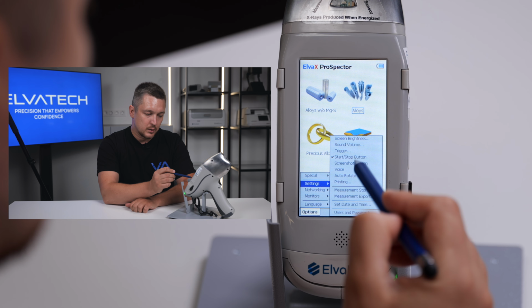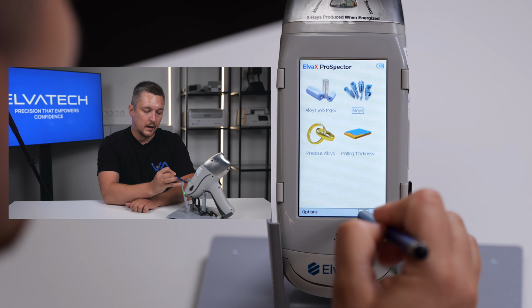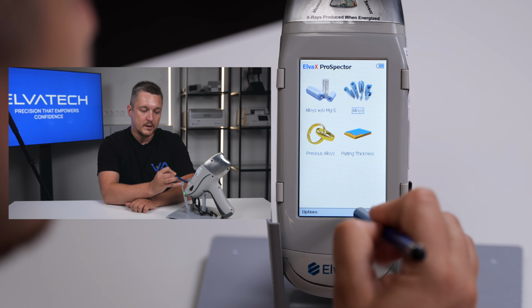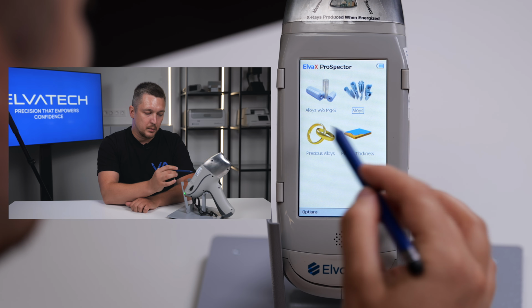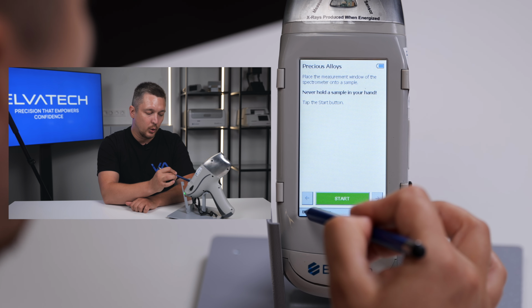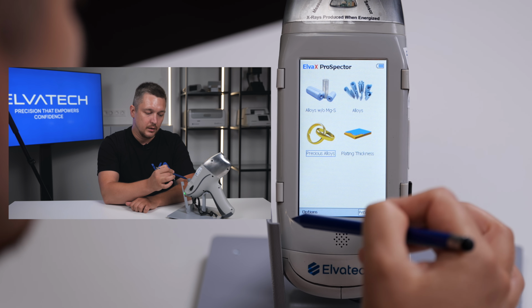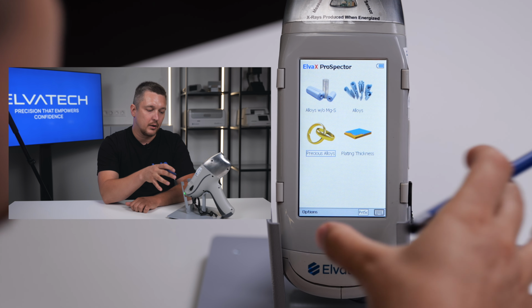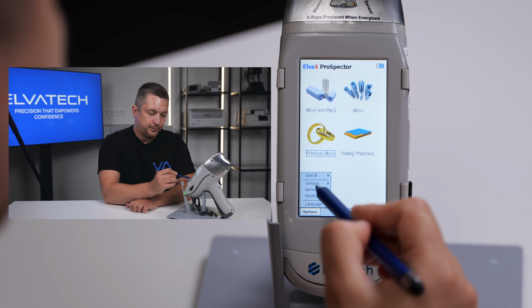So then next we have a screenshot button. If you turn on this option, you will see on the bottom of the screen the icon with print screen. It's very easy. You can just make a print screen in every mode or just on the main screen, and it will save this screenshot on the memory card or on the internal memory of the analyzer.